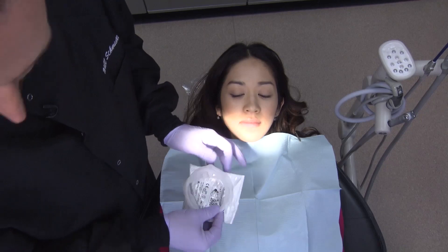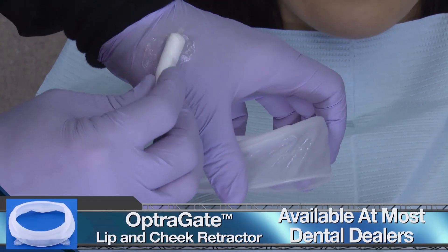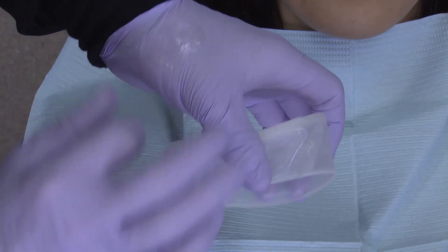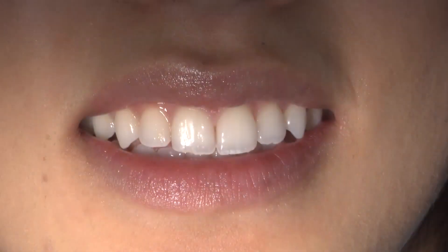I want to point out two things in particular with my next series of example photos. First of all, I prefer Ivoclar's OptraGate retractor to any other method that I've tried. To aid in the insertion of the device, place a small amount of Vaseline around the exterior of the retractor where it will come into contact with the lips.